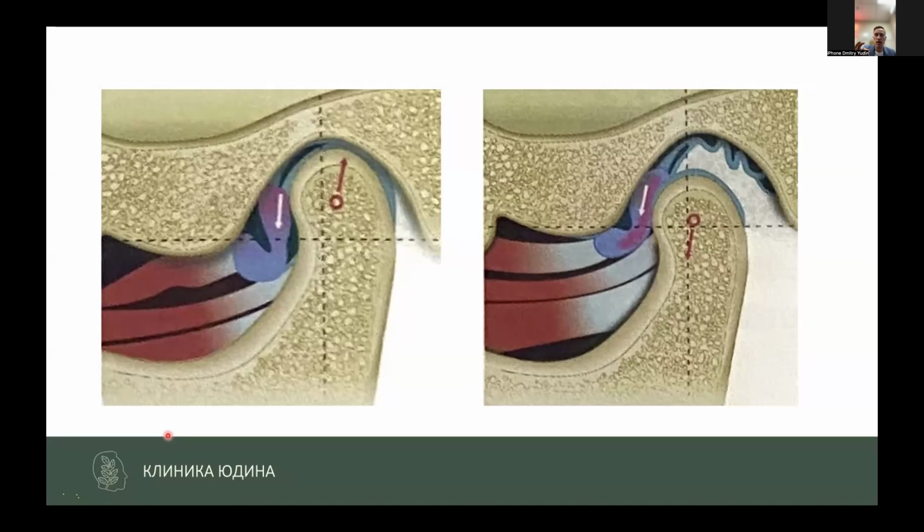So you can measure the anterior part of the TMJ disc and the upper space between the fossa and the condyle. The difference between the size of the anterior part of the disc and the size of the upper space between condyle and fossa will be the distraction size to put the head of the TMJ down.